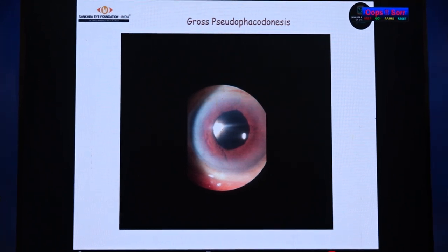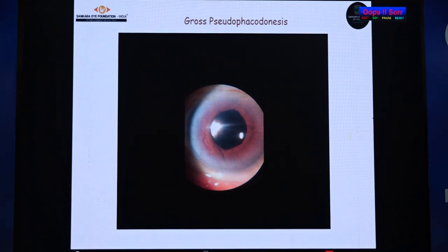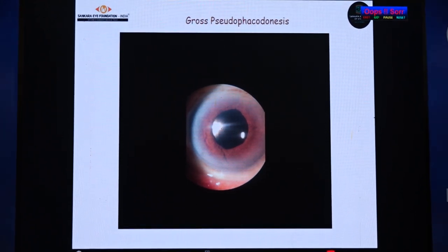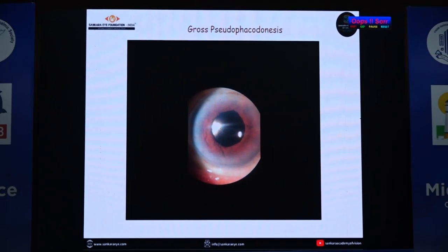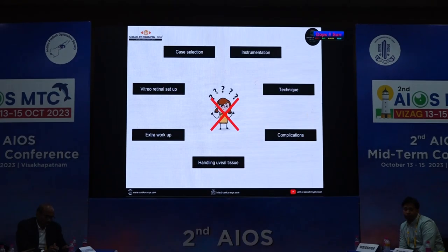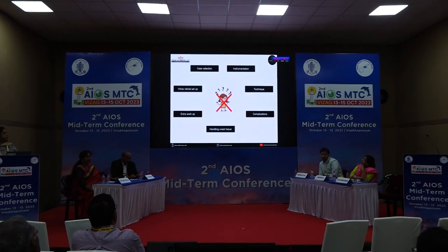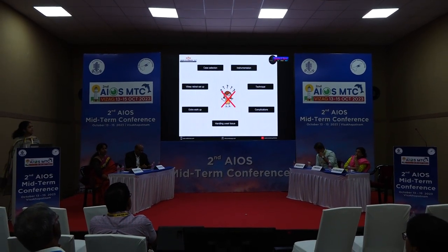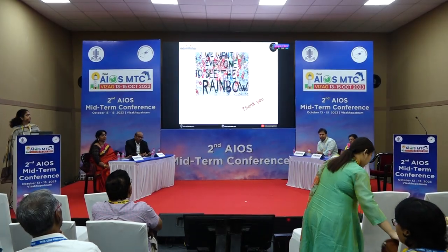Because of the pseudophacodonesis, that actually induces a PVD, which can be a risk factor for the development of an RD. This is where the SFIL scores over an iris claw. If you do a proper vitrectomy, the vitreous is not in contact with the optic, so there are fewer chances of PVD induction. So by doing things in a proper methodological way, with a good workup, things can go right, and you will have better achievements. Happy clawing. Thank you.